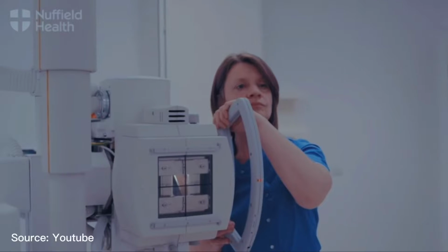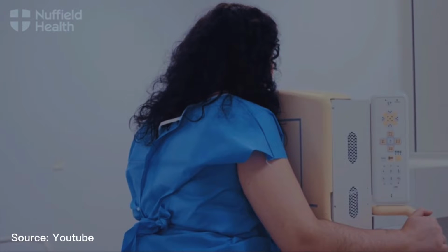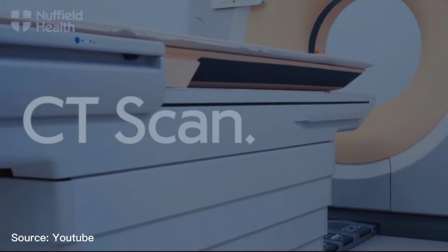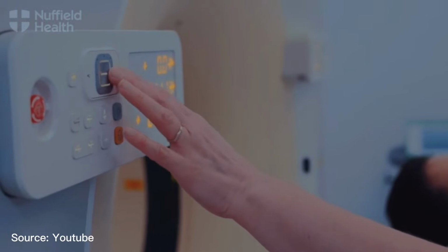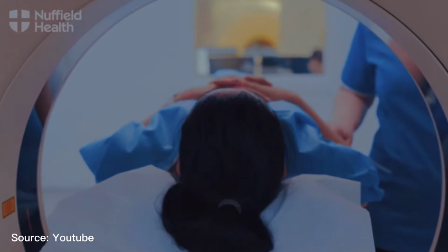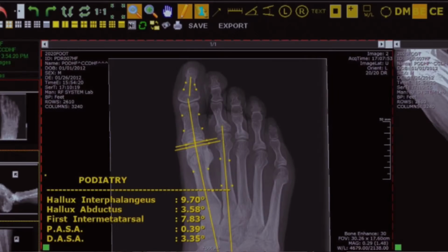The second process consists of one or more studies such as procedures or medical examinations. The patient will undergo one or more examinations, so when the images are captured and generated, they will be stored in the Dicom format. Dicom ensures that images are stored in a standard format. It is because we are using the universal standard format to store the image and also can transfer the image using the same format.